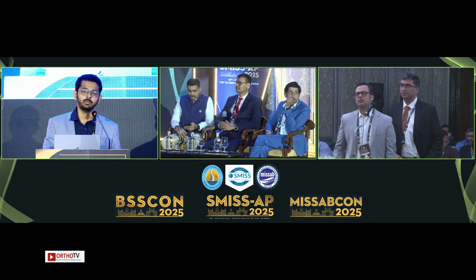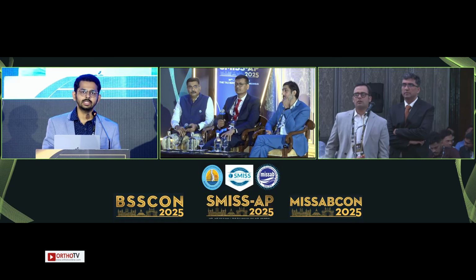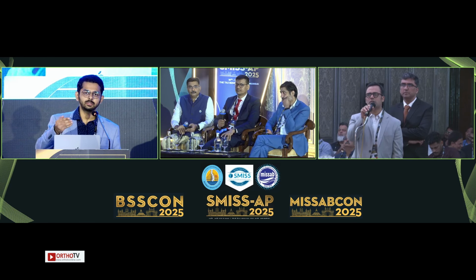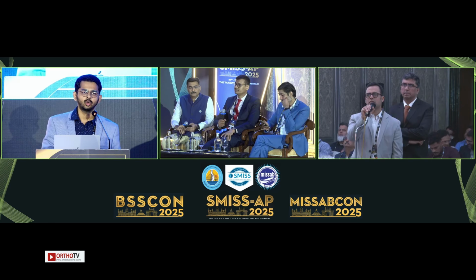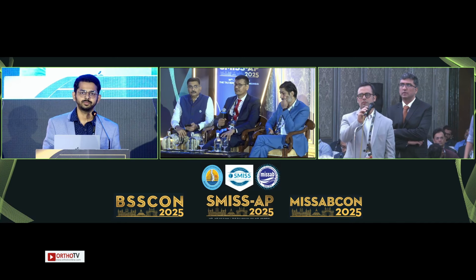Yes, a CT scan is definitely helpful in interlaminar as well as more in transforaminal cases when there is a hard disc, then it is very difficult to deal with it, or we have to be prepared for it. So in such cases, again, if it is a hard disc, if it is far dorsally migrated, it fits more into interlaminar decompression than transforaminal. So it helps in that way also. But yes, definitely CT will help in certain cases to see if it's an osteophyte or a hard disc rather than just a juicy or a soft disc.